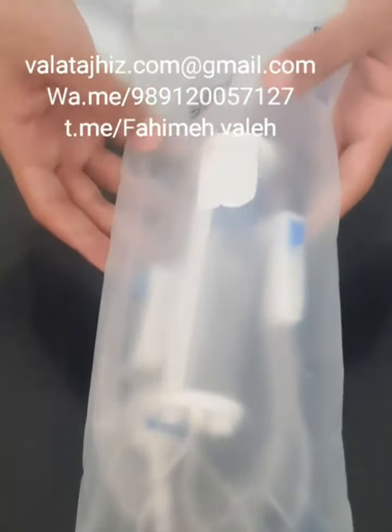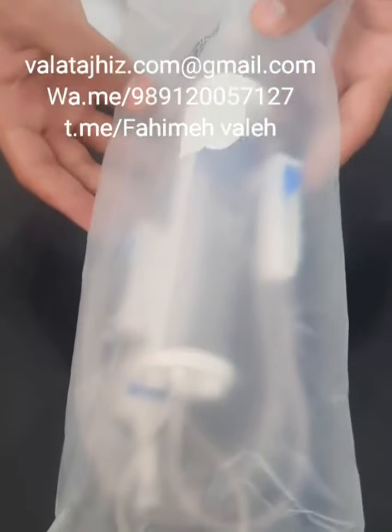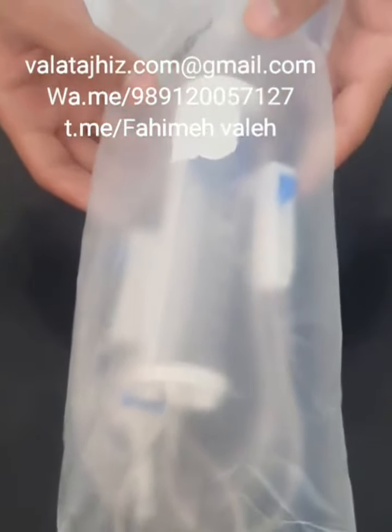And this one is a drip set that you can connect to an IV drip. This one is a micro set that you can use for injecting certain drugs into the body at a slower rate.